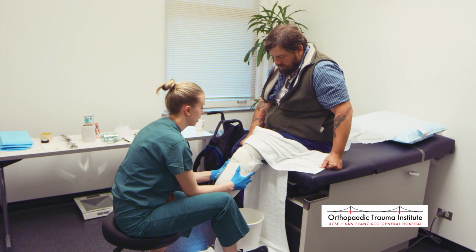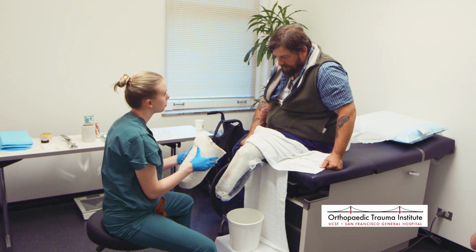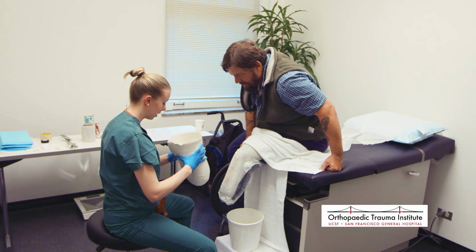And this plaster cast is removed right away, so it doesn't stay on your skin long. It's also washable, so if it does get on your clothes, then it can be washed right off or kind of picked off. It's not a permanent thing if it gets on clothes.